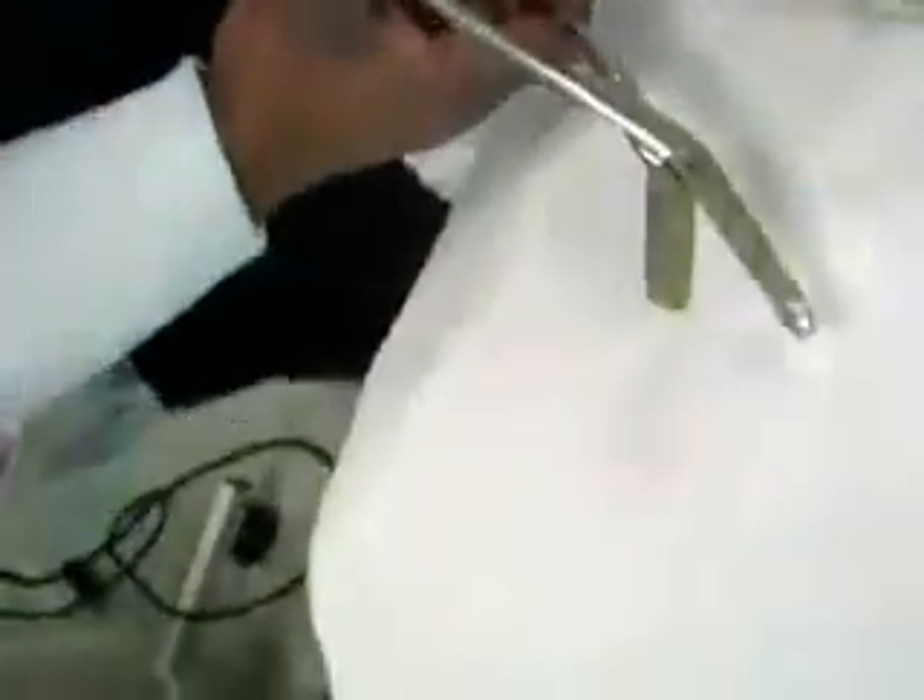Let me cut this. I'm going to go back and forth cutting this. It's still the gauze. I just want to see what I'm working with here, and I'll know exactly where the pins are. Let's open it up here. That's not going to lie you up very well.